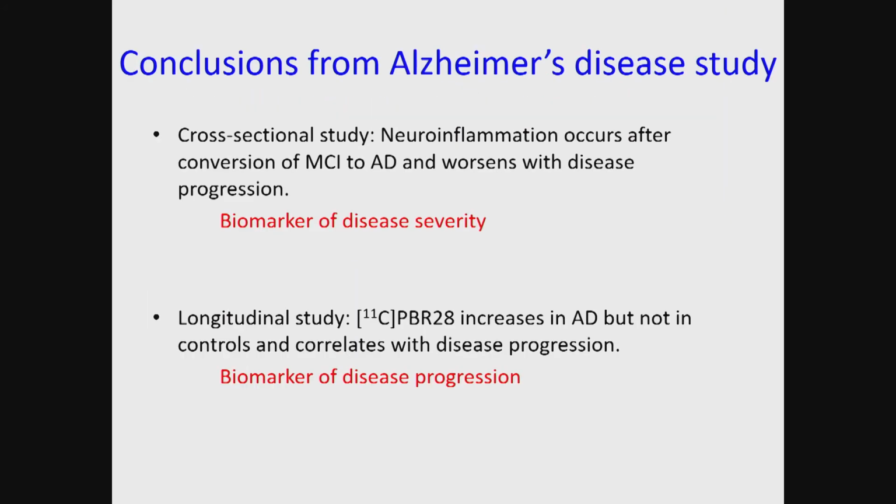Okay, to summarize then, I use TSPO as an example of studying distribution, in this case between the periphery and the brain, and how if you block both of them, you can have a higher concentration in the plasma, and then lead to transiently higher levels of distribution to the brain. I also wanted to show that this marker itself could be useful in Alzheimer's disease, and in many others where we're looking at inflammation in either the brain or in the periphery.